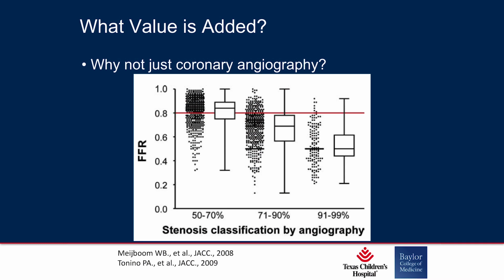Now, a little bit about how we assess the utilization of stress MRI. I will caution a little bit, this is taken from the FAME trial. This is in the adult literature again, which is comparing coronary angiography with FFR. If you consider FFR, which the adults do, as the reference standard, and you can debate what level of FFR you want. Initially, this was done at 0.8. I think I saw a slide today referencing the more current value of 0.76.